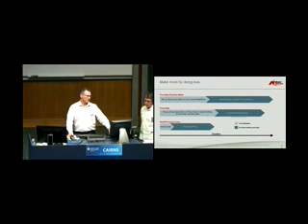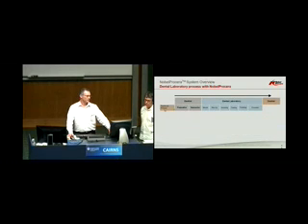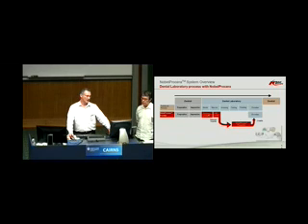The idea of the NobelProcera scanner is that you scan and design, and the laboratory focuses all their energies on the layering ceramic, the veneering, rather than on the fabrication of the framework. And once again, for the dentist, the traditional process: preparation, takes an impression, pours up the model, the laboratory pours up the model, waxes it, invests it, casts it, etc. With the scanner, the dentist prepares the tooth, takes the impression, a model is still fabricated, it's scanned, then it's sent off for production, the framework comes back, and then the ceramic is layered on top.